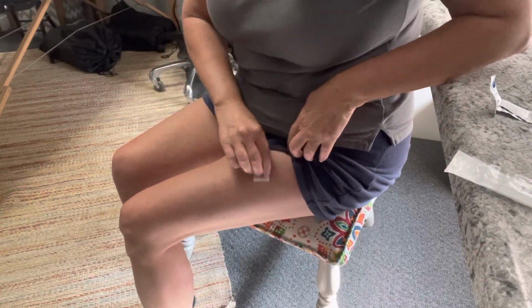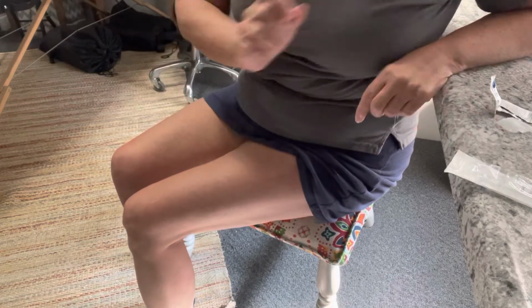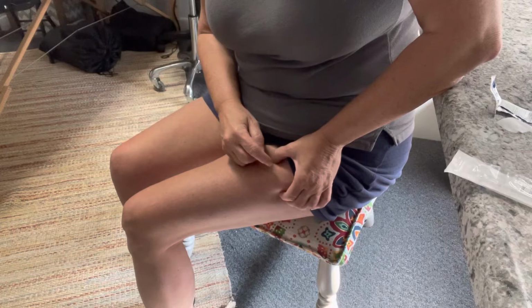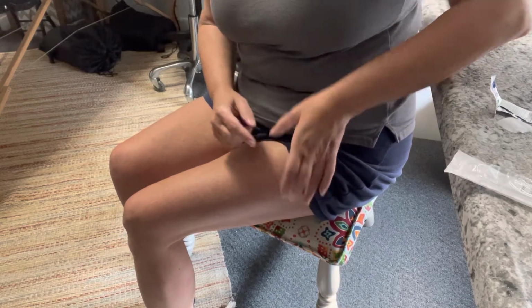So we're going to alcohol a little spot right here. We're going to let that dry. So right here is where I've alcoholed, and I'm making note of this spot I alcoholed off.